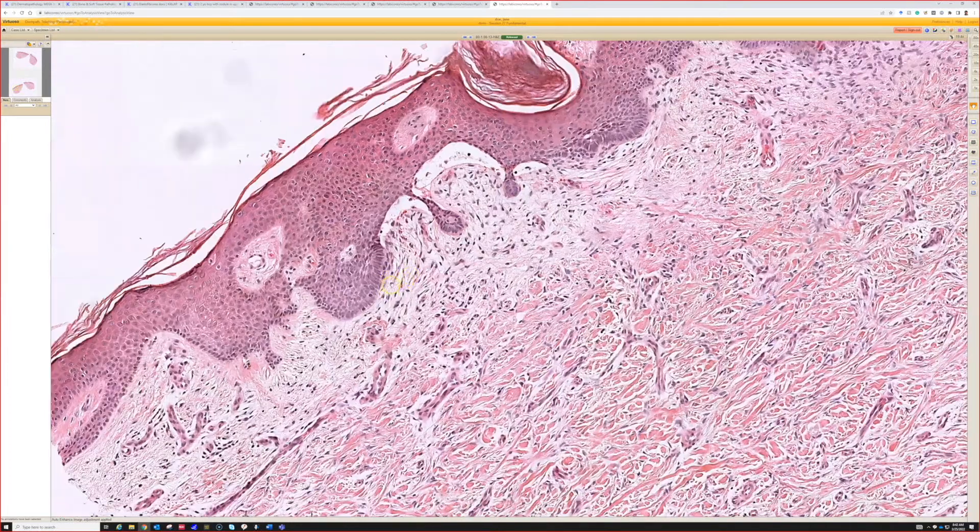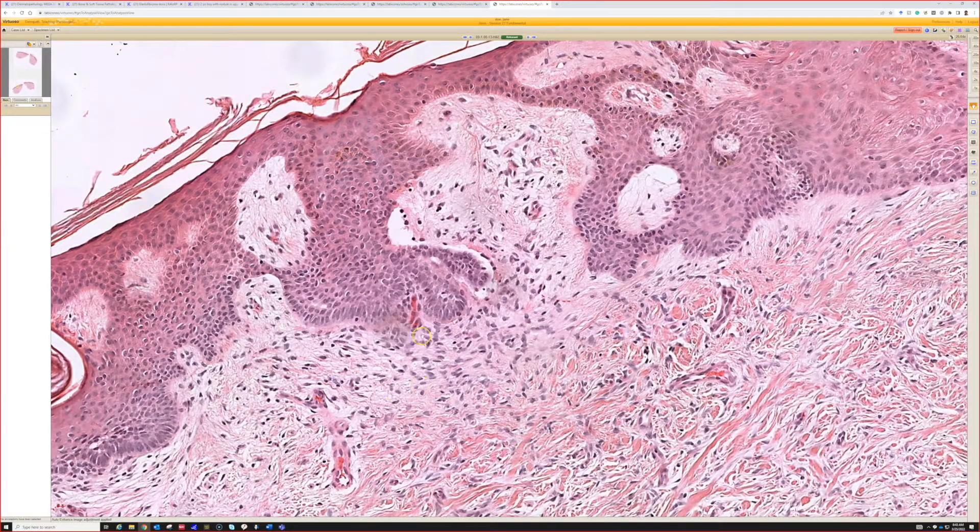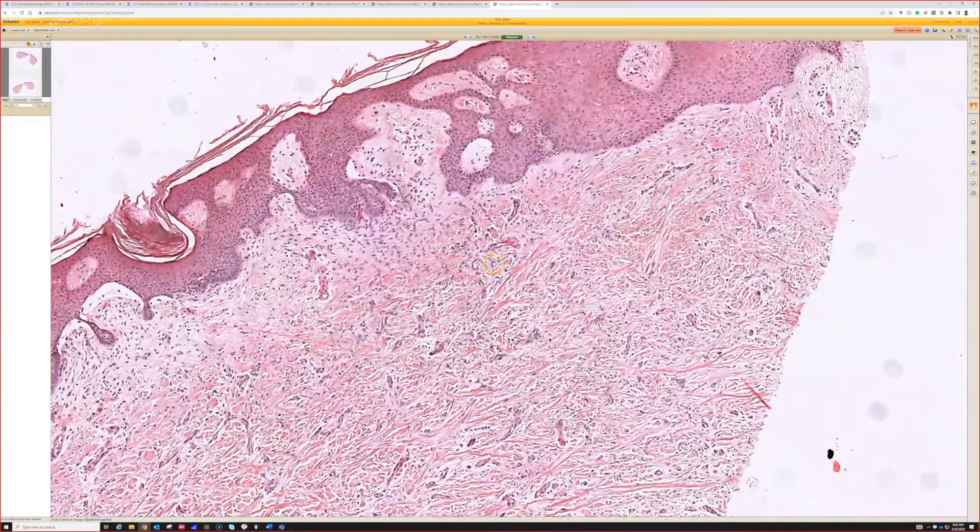Helpful clues can be — look up here — although there is a little split, you can see a little tiny papillary mesenchymal body starting to develop. Another one here: a little hair papilla. Sometimes you can see a little inner root sheath, trichohyalin granules. Things like that are helpful clues.